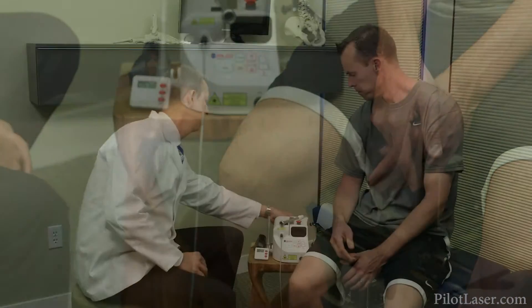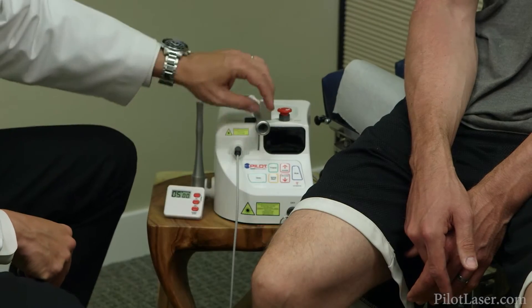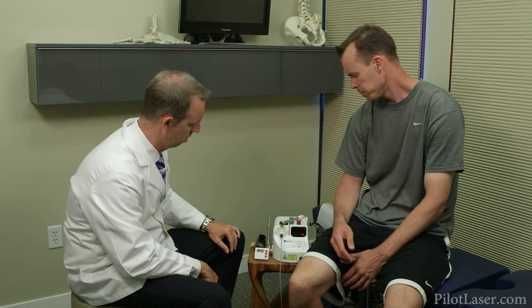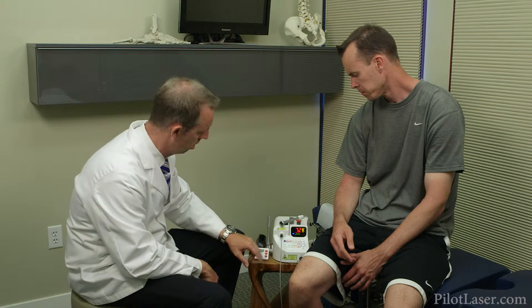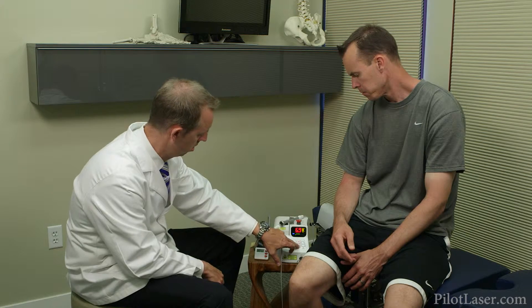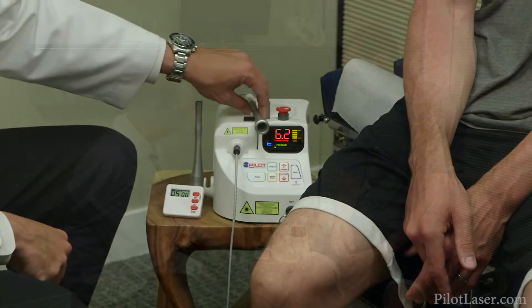On your laser, make sure you have all of your settings where you want them to be. To help figure dosage, we've put together some suggested guidelines for treatment dosage and time for several conditions. You can find these suggested guidelines at pilotlaser.com. For this procedure I've chosen to use 6.2 watts on continuous mode for a period of five minutes.